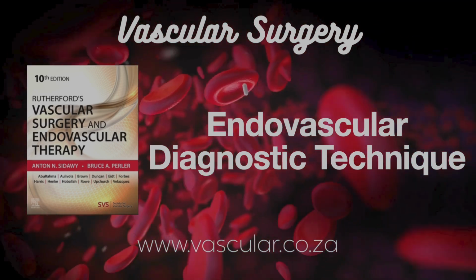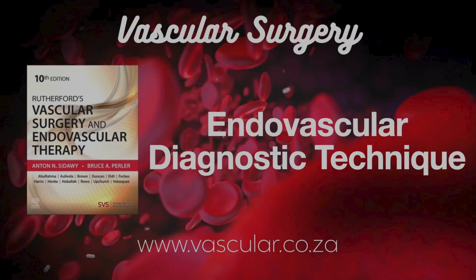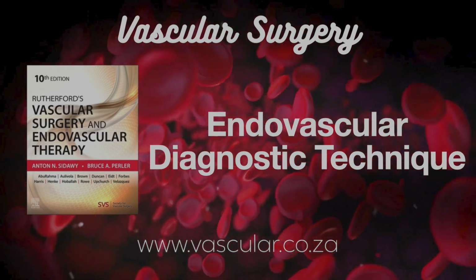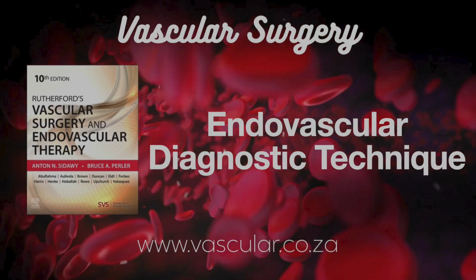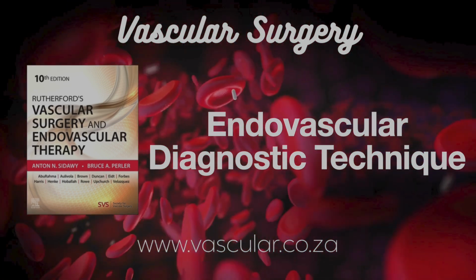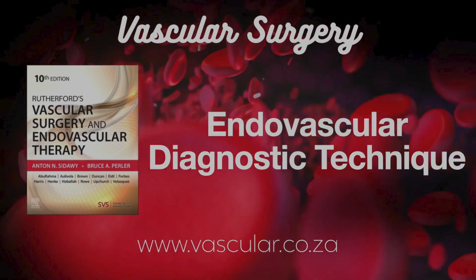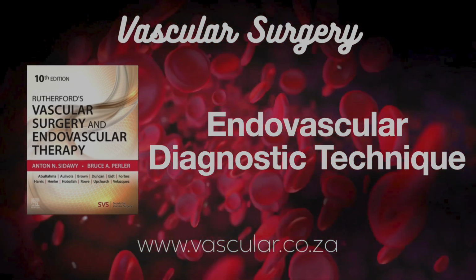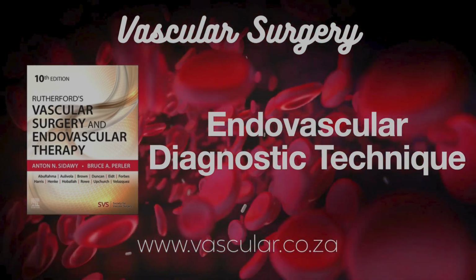Okay, so we're in the vessel, and now we need to navigate catheterization. Guide wires seem crucial here. Absolutely. They're the pathfinders, the unsung heroes maybe, but gosh, there are so many options. Yeah, it looks like a huge variety. What are the key things doctors consider when picking one? It really boils down to a few key features. First, the tip. Is it soft and floppy for safety? Or stiffer, maybe angled, to steer through twists and turns or get into side branches?